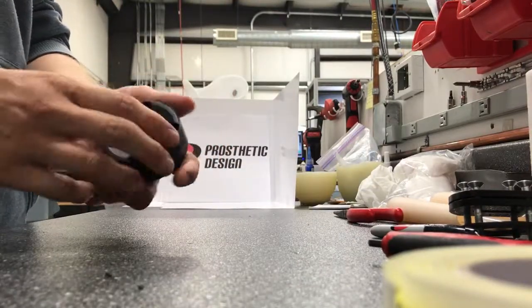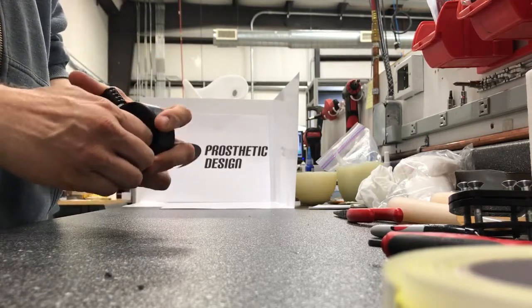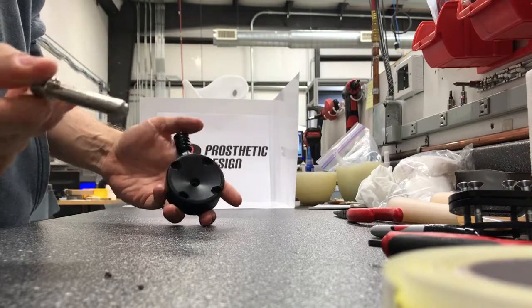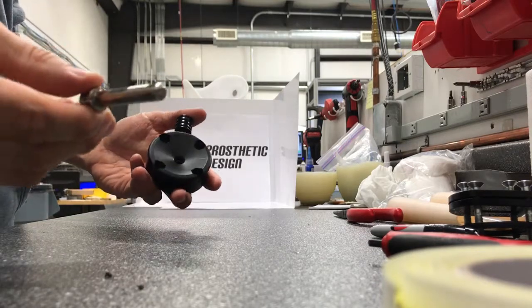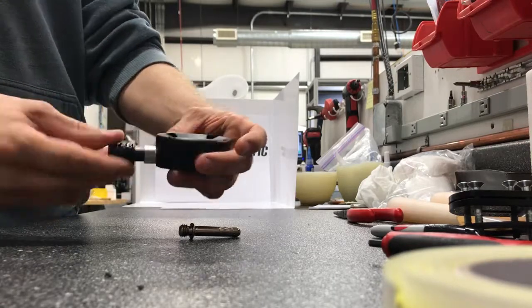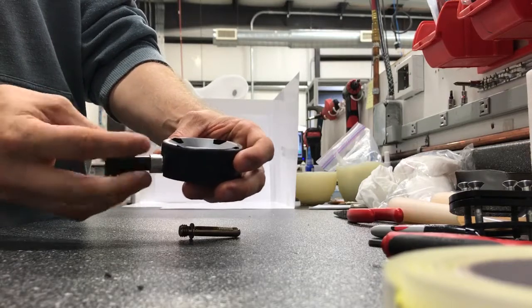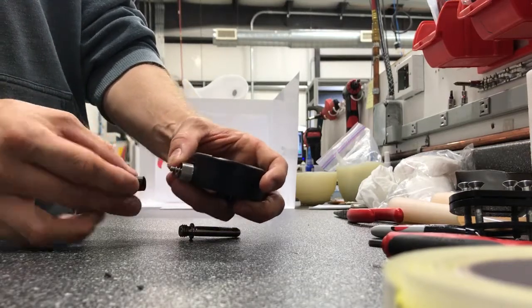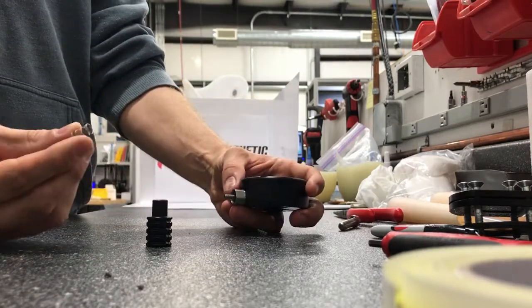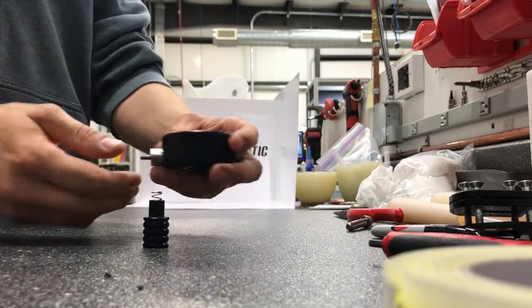Alright, this is the Infinity Lock, which is a smooth shuttle lock. First thing you can do is unscrew the push button. Careful, because there's going to be a screw or a spring. Put that in there. Okay.